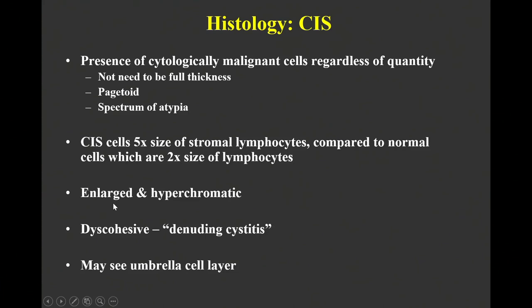Some CIS will show prominent nucleoli, but more often they're just large and dark nuclei without a lot of nucleoli. CIS cells tend to be very discohesive, which is why we get them on positive cytologies. And as mentioned, you may see an umbrella cell layer.